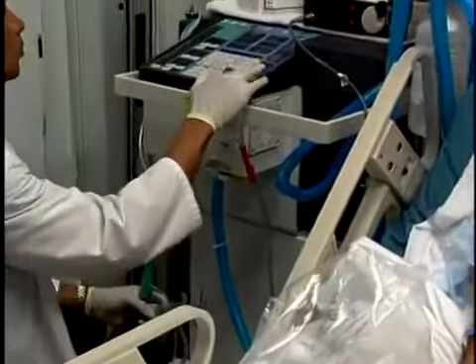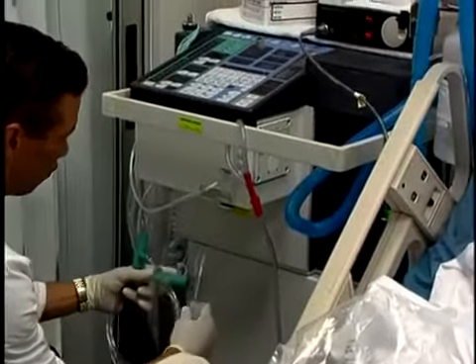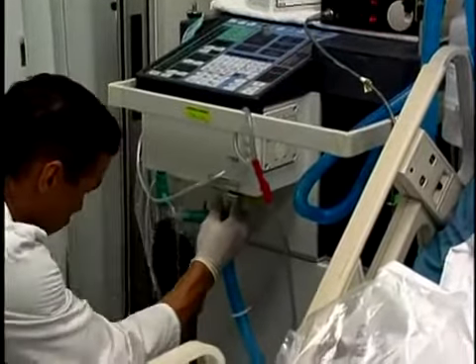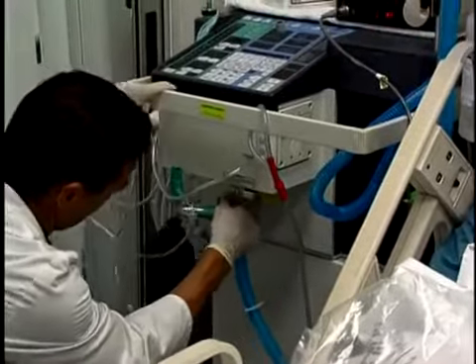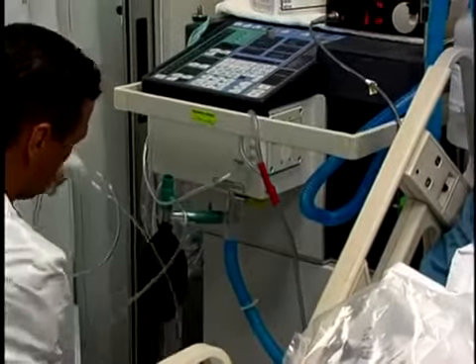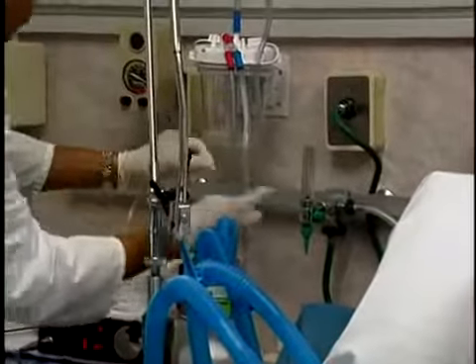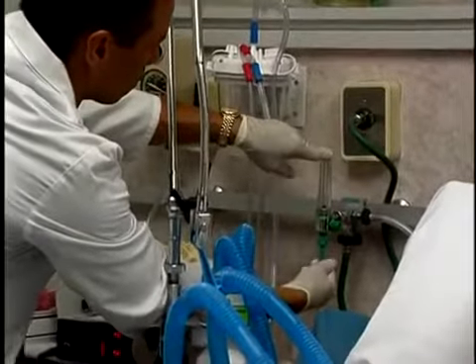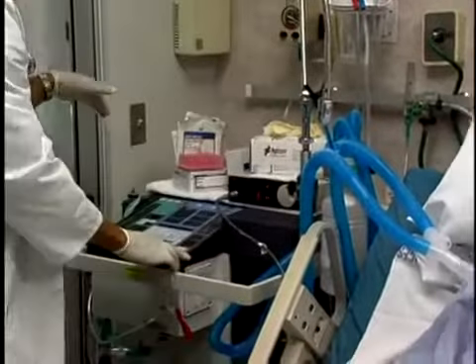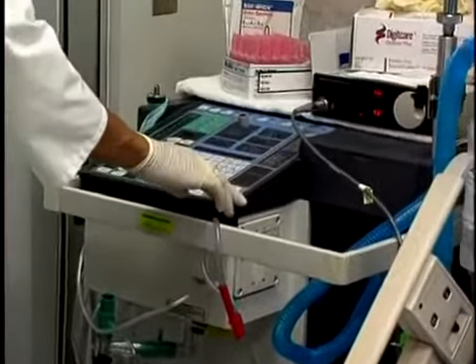For longer periods of use, adjustments can be made to minimize unnecessary alarming. Some ventilators, such as the Puritan-Bennett 740 and Puritan-Bennett 760, have a speaking valve mode that will allow use of the valve without constant alarming while maintaining alarm functions. Other methods can be utilized to cease unnecessary alarming, such as adding flow or an IMV bag with flow to the expiratory limb of the ventilator circuit and setting the alarms appropriately to the volume created by this flow.